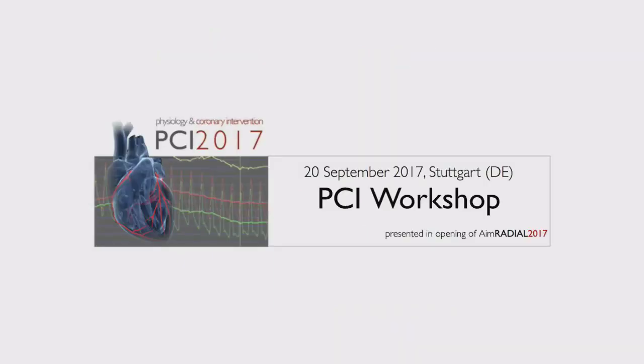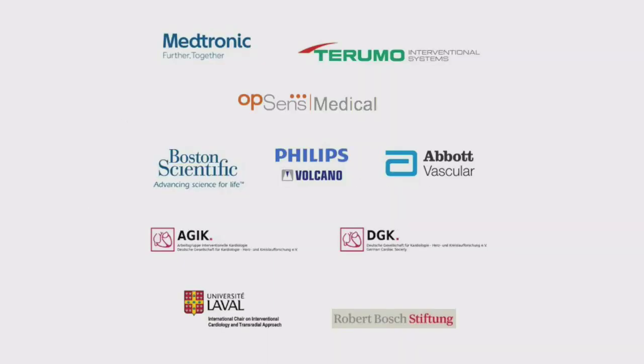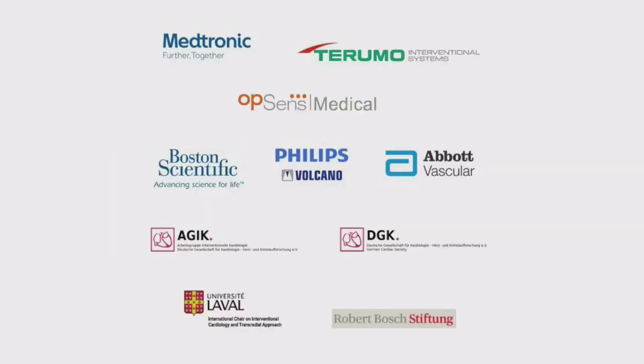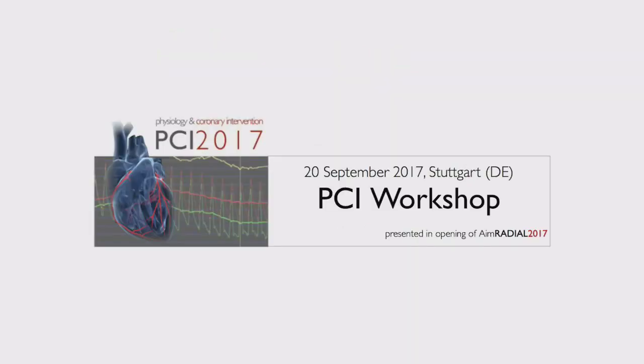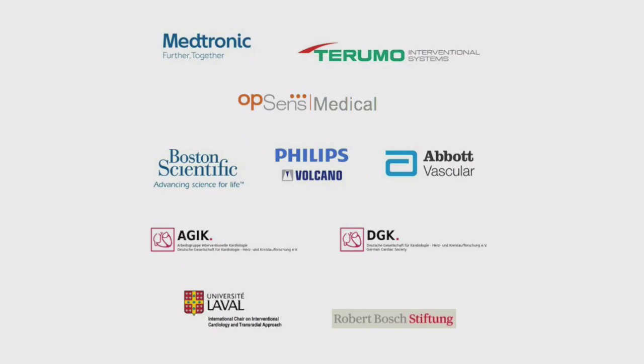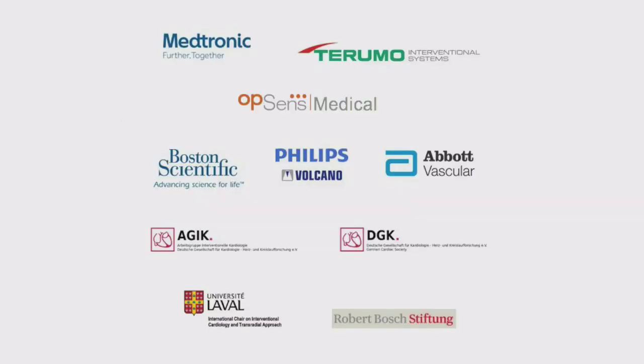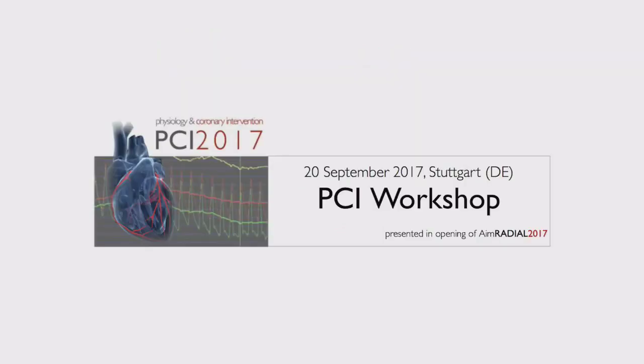Absolutely. Or your lousy stenting technique. Yeah, you're right, absolutely right. And this is why I listed the 4 possible mechanisms. Not even drift was taken in the CRF, so we were not mandated to pull the wire back and see what the FFR at the tip of the guiding catheter was. So if we had some data on drift, probably the sensitivity and specificity would have been better, but that's a guess. Of course, we more and more see diffuse disease patients, so I think that this is by far the most important reason why we do not have a post-PCI FFR value of 1.